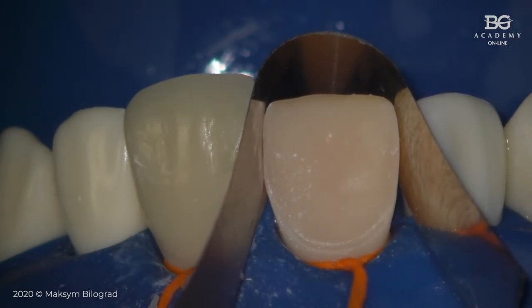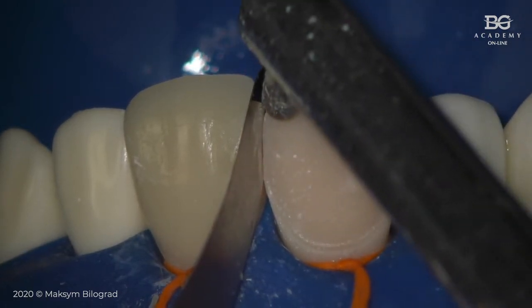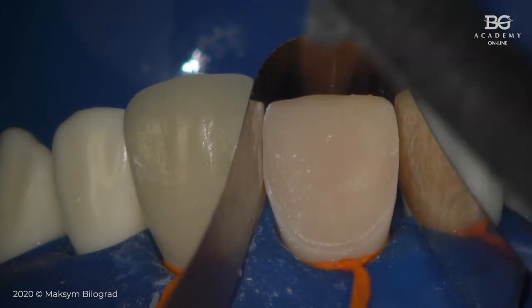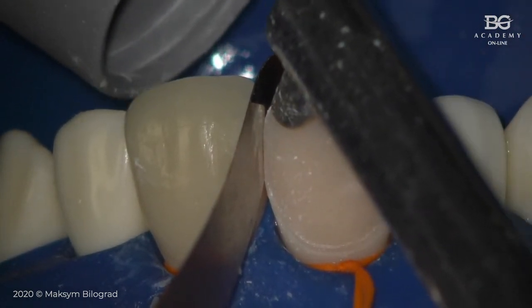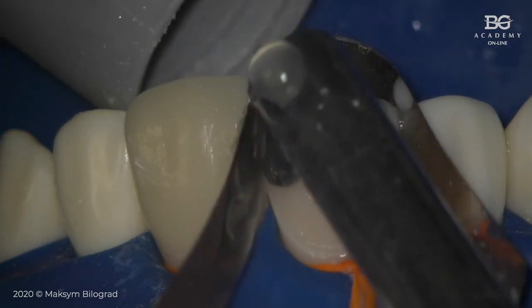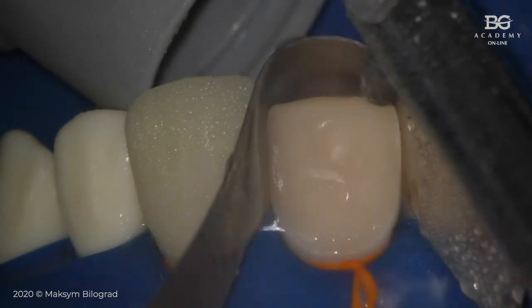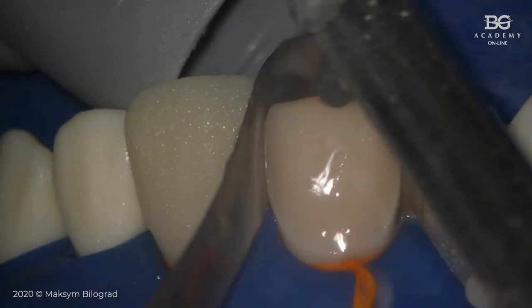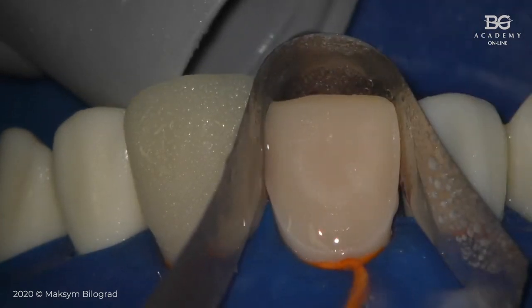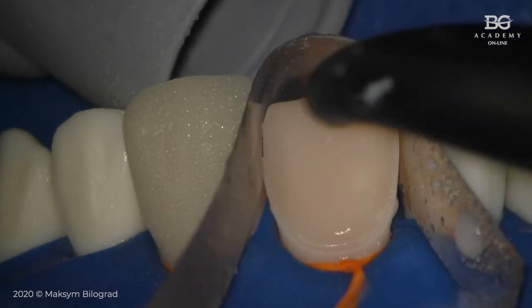When I was cementing this central incisor, I can get some bonding agent or some cement here. So now I can take it out easily with the sandblaster. Okay, so there will be no bonding agent, nothing.